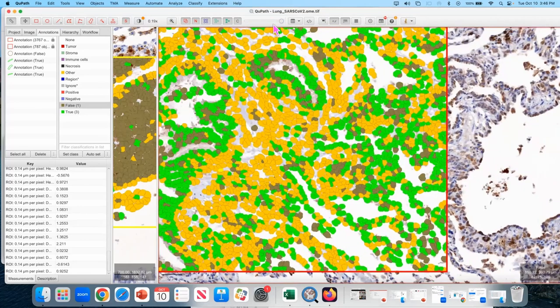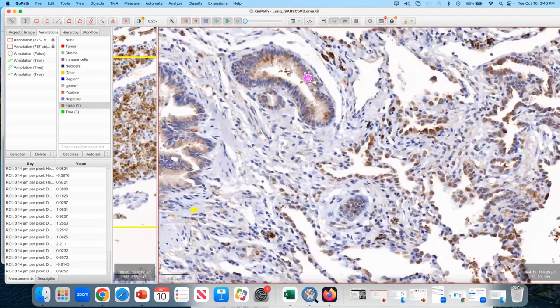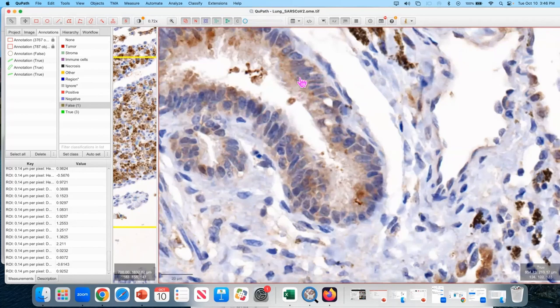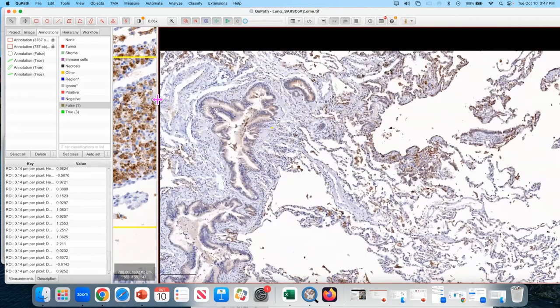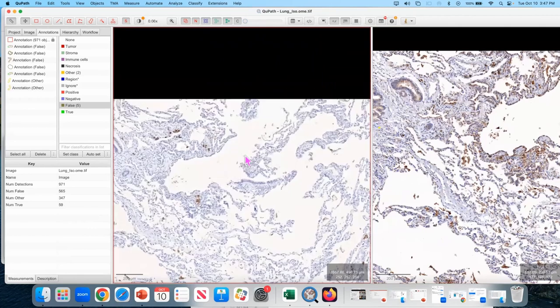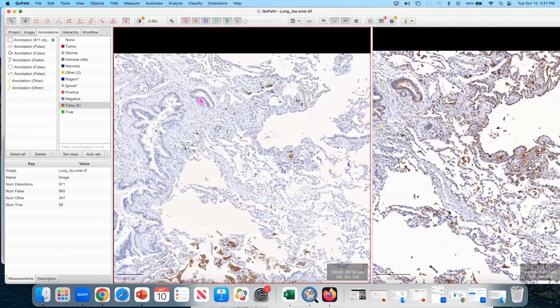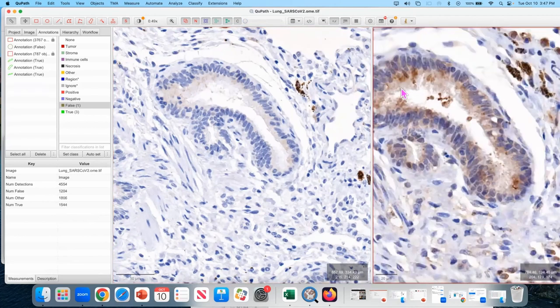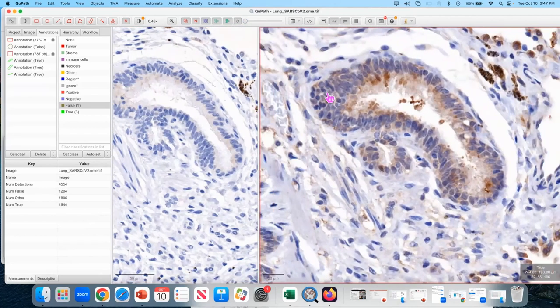So now in this case, it worked, I would say, decently well, although honestly, I'm not 100% sure that these cells have enough of that membrane staining that I was looking for to call them truly positive. It might be that this is just more of the false positive that's coming from the fact that bronchial cells are often pretty sticky. And I can hopefully use this to validate it. See, there is a little bit of brown in here, but not as much brown as this. So maybe I will accept that result.